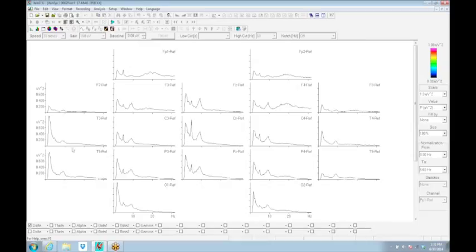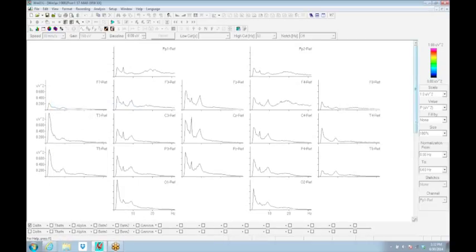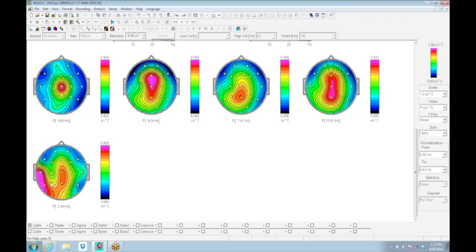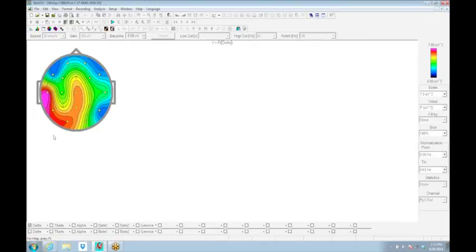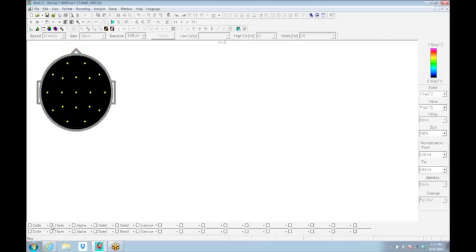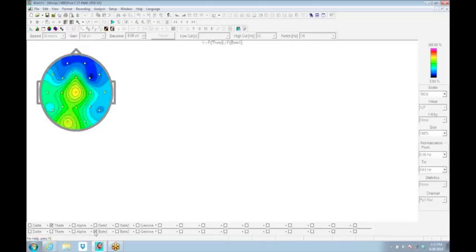We also saw that the slow content at T3 was largely artifactual. We can do a map of a slow wave that basically shows some of the slow area that ended up having artifacts over here from movement and electrode issues. But the mapping is very flexible. Let's say we were interested in the theta-beta ratio. This is a map of, when I select, this is the formula. At the bottom, I have the formula. Theta above the line, beta below the line is theta divided by beta.